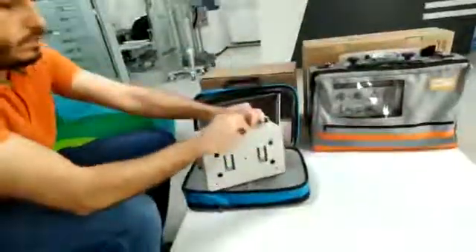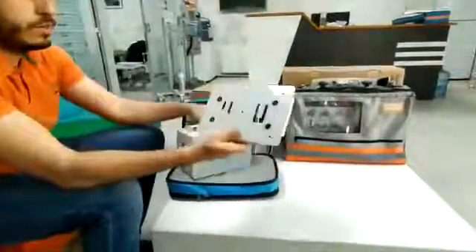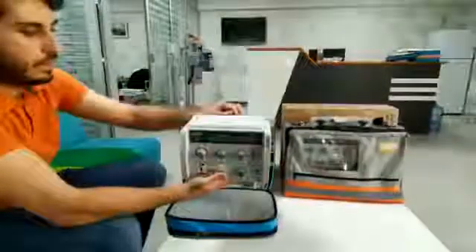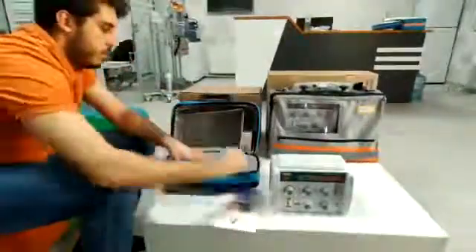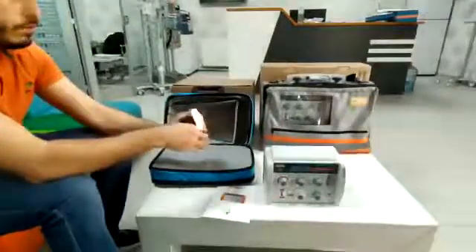This is our mounting bracket, and you can use it like this. You can mount a trailer with this. This is our ventilator. Here is the usual manual and power supply.